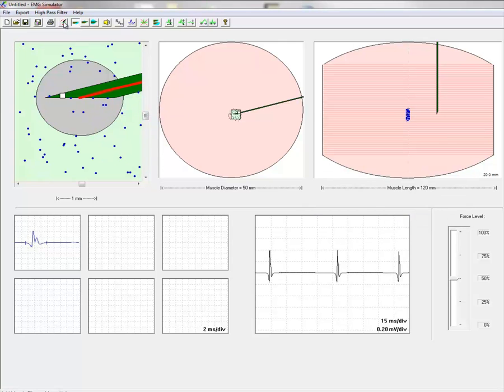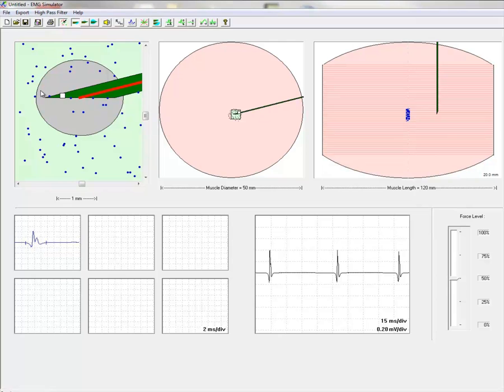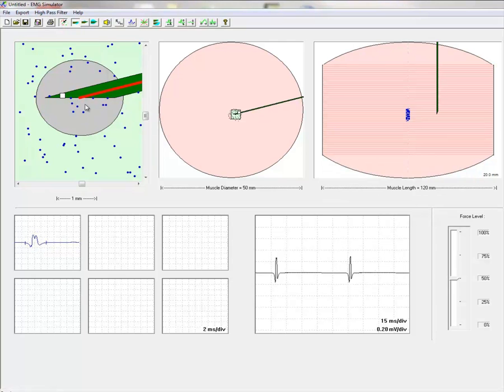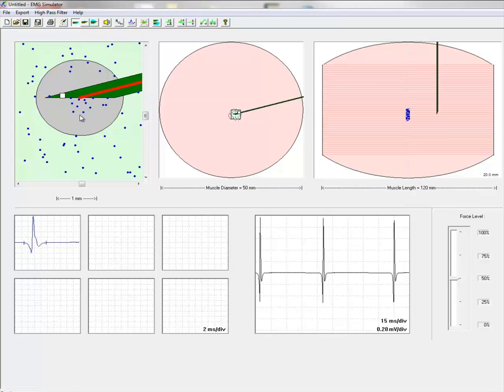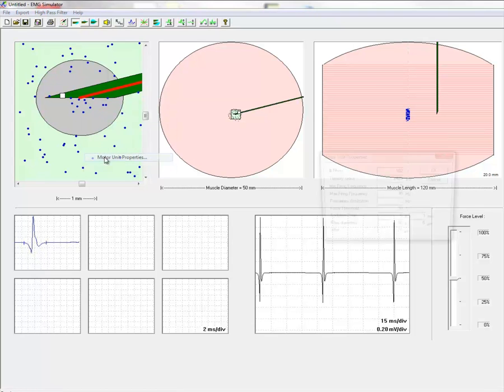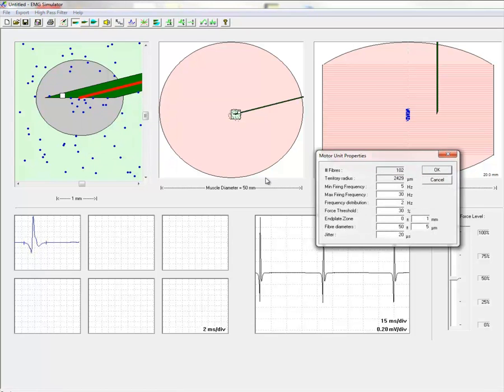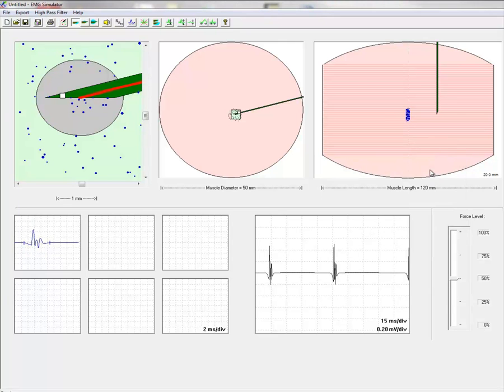It becomes shorter and lower in amplitude. Let us return the fibers to normal and instead indicate the increased fiber diameter variation that we see in biopsies in myopathy. And here you see how the fiber diameter will influence the shape profoundly where the signal all of a sudden becomes polyphasic.